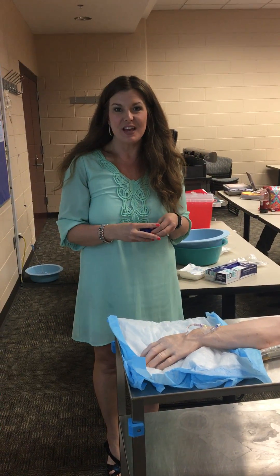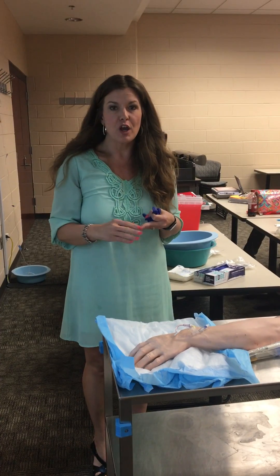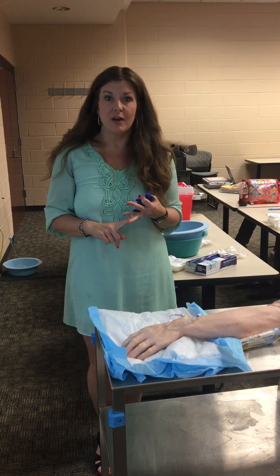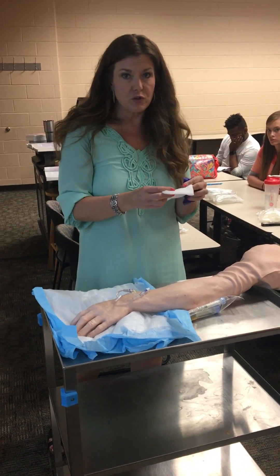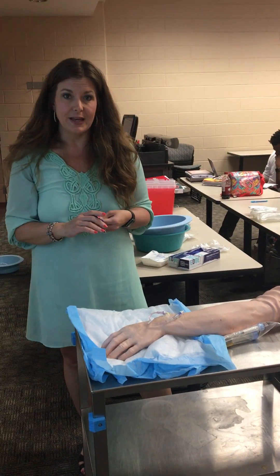Okay guys, this is the IV check-off. It has two parts: the assessment part and the termination part. You want to bring your IV fluids, your IV tubing, some 4x4s or 2x2s, some clean gloves, and of course your essential skills packet as well.